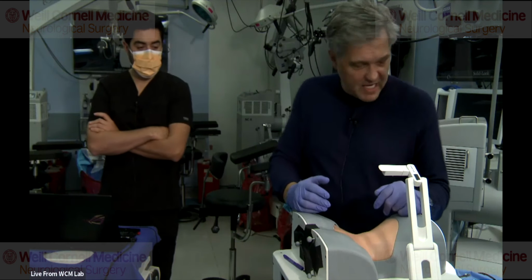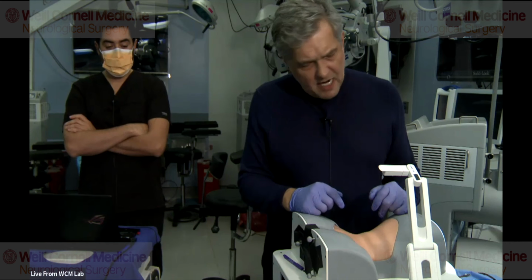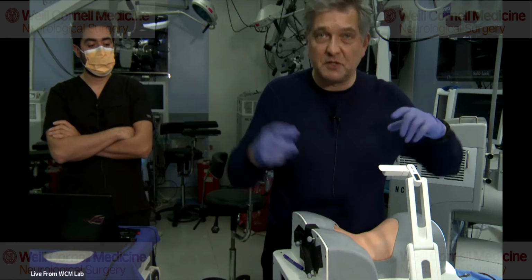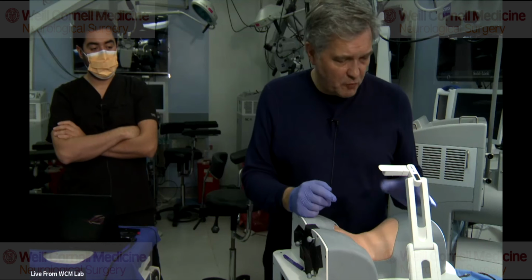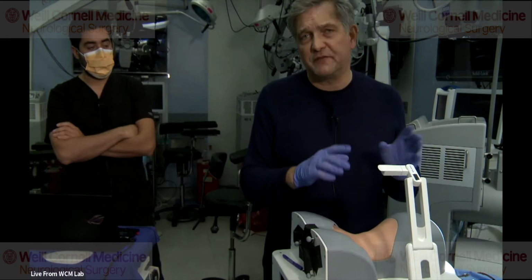Sounds good. Thank you. We have a question about the reference frame, but I think you already answered that. Yes. You put it on the Mayfield head holder. Yeah, I put it on the Mayfield. In this case, for the model, obviously we have it attached to the simulation model here. But in a real patient, I would put it on the Mayfield head holder. You can also use a spinous process. However, then you have to make an additional incision, so you can avoid that. And if you put it on the Mayfield head holder, it is very accurate as long as it's just for localization.